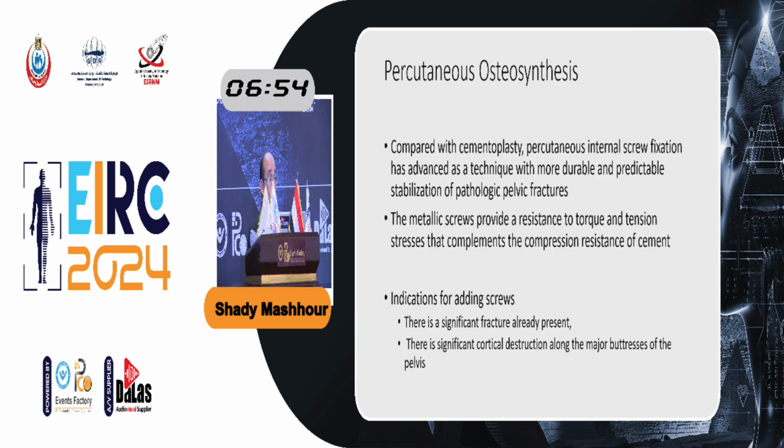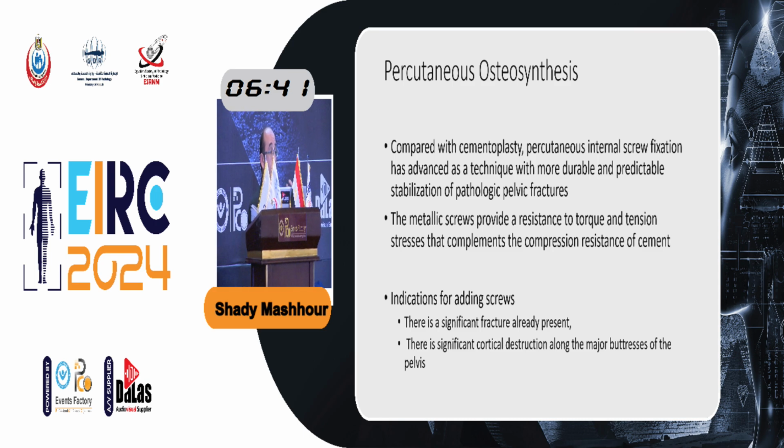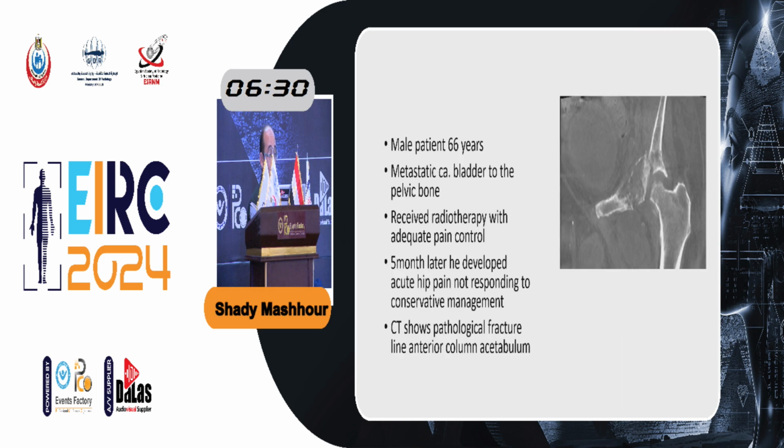The advantage of screws is they provide support in multi-dimensional stressful situations, such as torque and tension, rotational forces and tensional forces, in addition to the cement, which supplies the compression force. We usually go for adding screws if there is a significant fracture already present or there is significant cortical destruction along the major buttress of the pelvis.